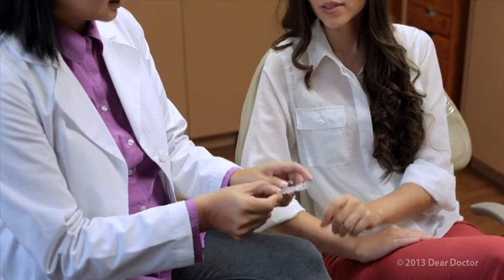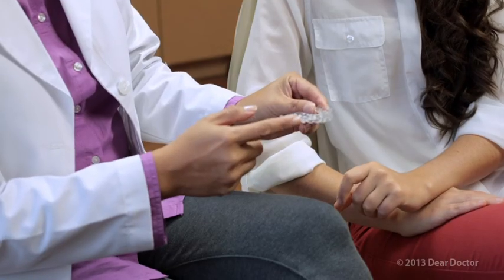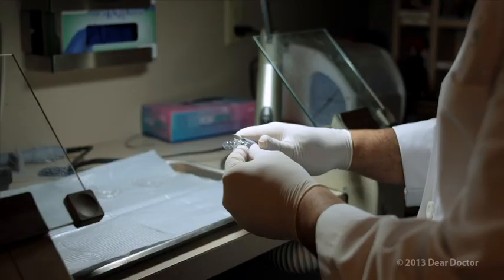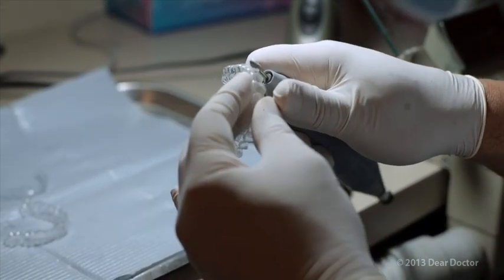The first step is for your dentist to evaluate whether clear aligners are right for you. If they are, x-rays and impressions are taken, and an individualized plan designed by your dentist is sent to a specialized lab, which will make the trays that will gradually move your teeth into proper position.